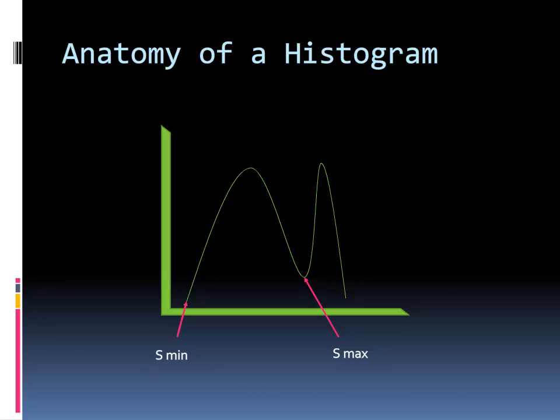A histogram will include all pixel values within the collimated border of the radiographic image. The values include those representing anatomy of interest and may also include values representing areas within the collimated borders that anatomy is not located and the X-ray beam directly interacts with the image receptor. It may also include values representing a barium bolus or metal prosthesis.